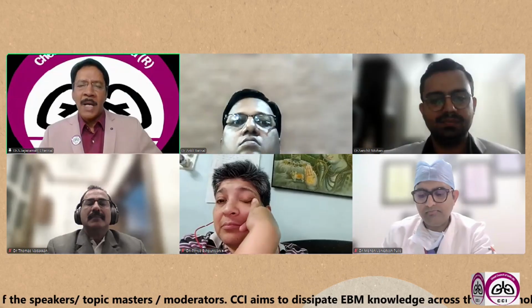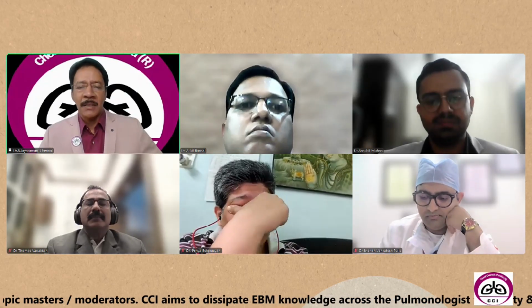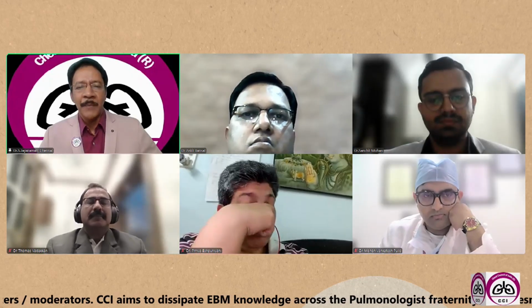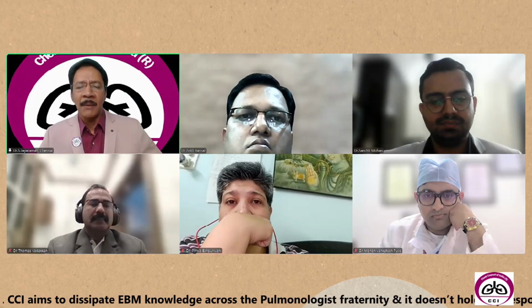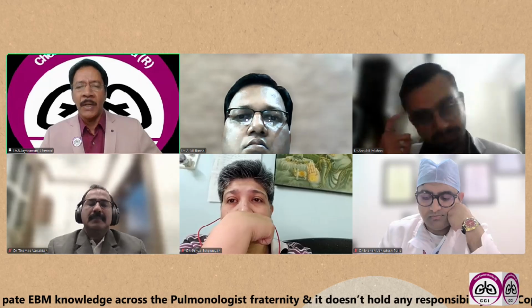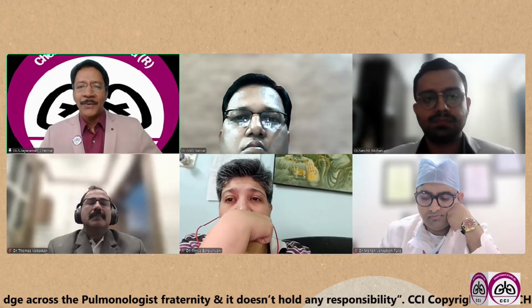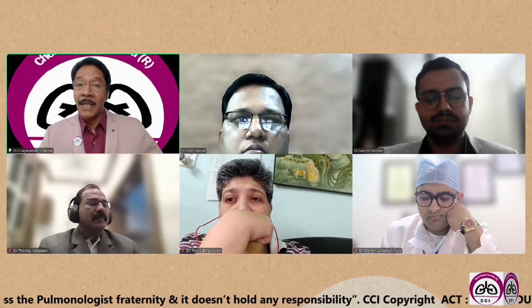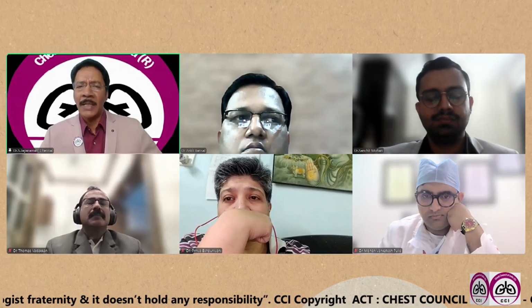For the past two decades, a lot of advancements have happened in the optics, the fiber optics and endoscopic instruments, and in high-tech anesthesia, monitored anesthesia care using intravenous sedation, propofol, etc. So EBUS is nearly matching mediastinoscopy, but still mediastinoscopy is the gold standard. There is no doubt at all.